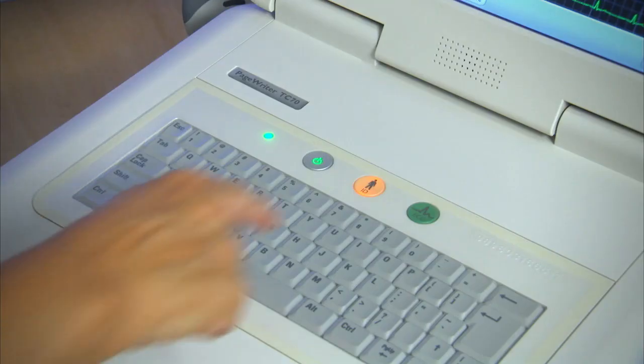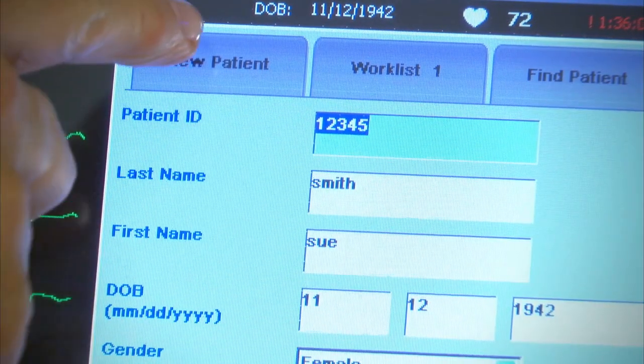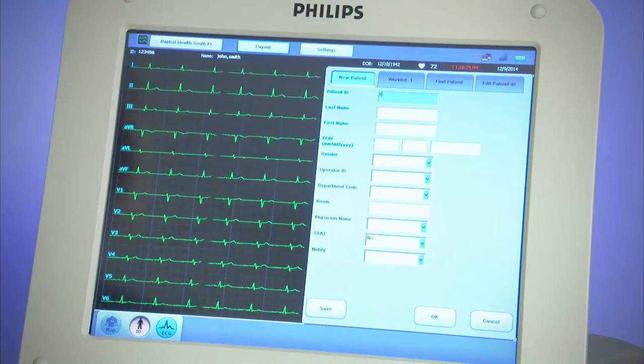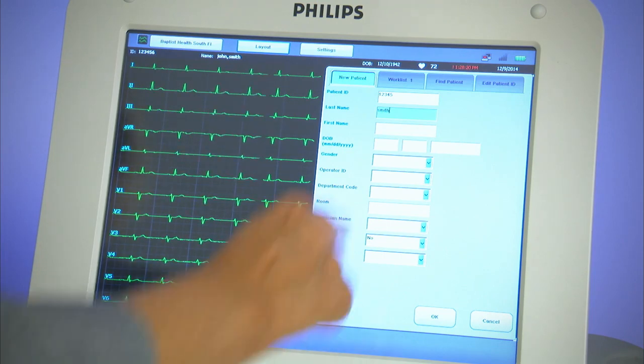When the patient is connected, the patient ID button will light up to guide you to the next step, completing patient data entry. Step 2 is to touch the yellow ID icon. This opens a window to enter the patient information. Only the blue fields are required for the ECG to be correctly documented. Fields that are required are determined by the cardiograph owner when it is installed.